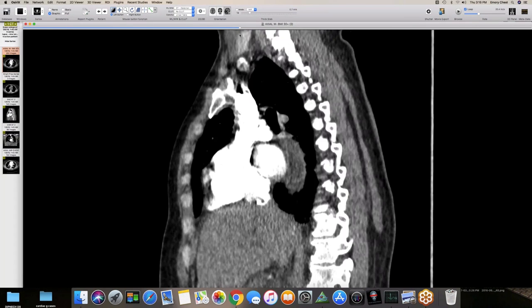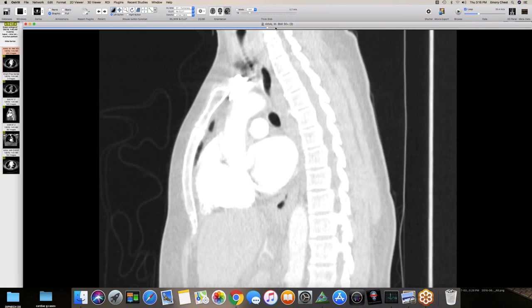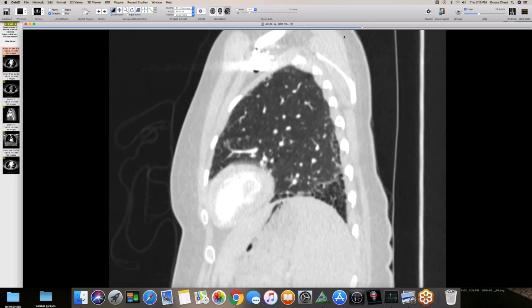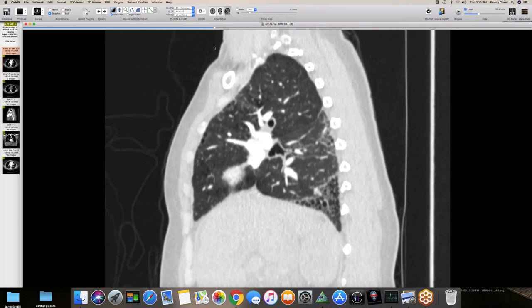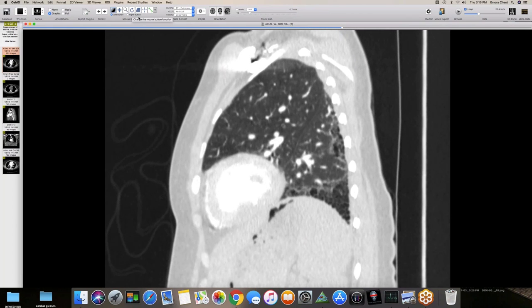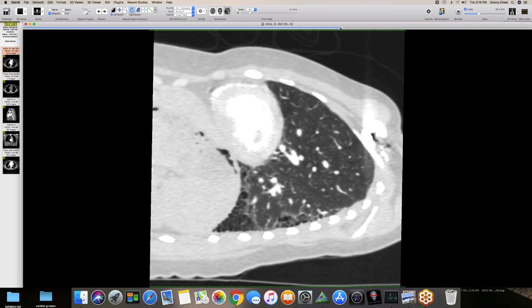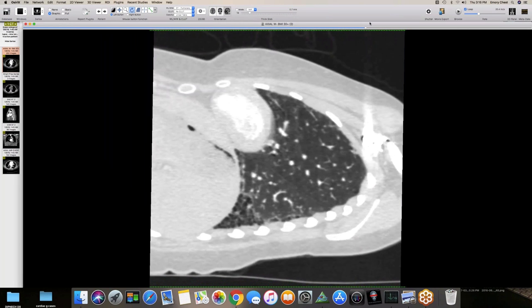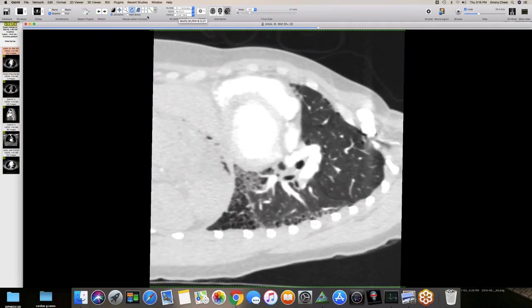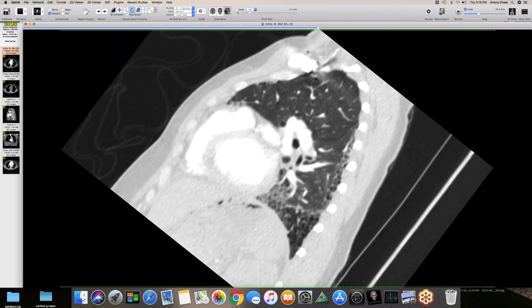Looking at the lung windows and rotating — if you rotate the patient onto their back as if supine, most of the dependent lung is posterior. If you flip them on their belly, most of the dependent lung is the anterior upper lobe. That may actually be one of the reasons you get that pattern — you see a lot of aspiration in these connective tissue diseases.